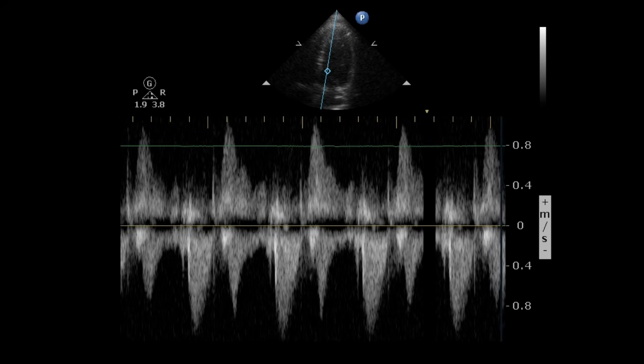So what if I'm looking at fast flow? Turn that scale up, right? And see what you can get. However, there's a limit to what you can do, right? So using the typical pulse wave Doppler, and we'll get into the different types of Doppler here in just a sec, there's a limit of about 1.5 meters per second that you can accurately resolve. But sometimes there's scenarios where that flow is greater than that 1.5 meters per second ability to resolve that.